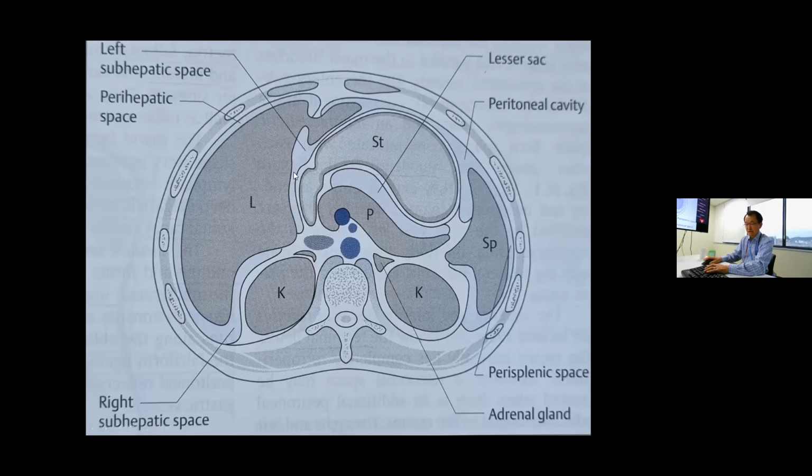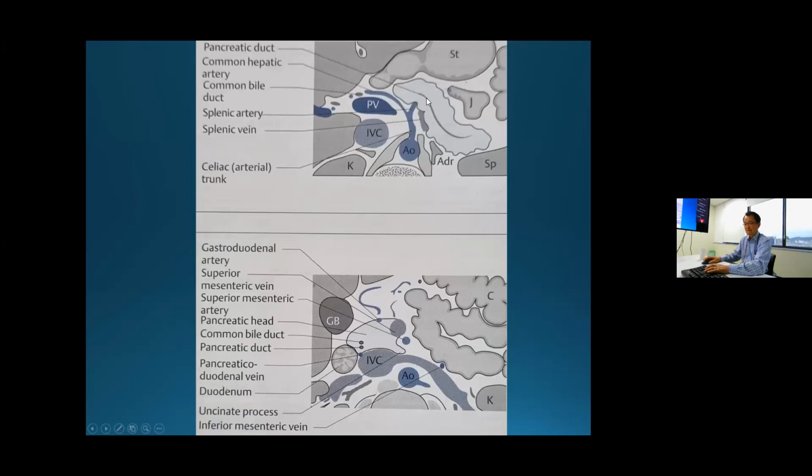And then the subhepatic space, the retroperitoneum, or the peritoneal spreading of all tumors: ovarian, stomach, pancreatic cancers. You have to look for nodules around this kind of space. Here the pancreatic duct, and all the adenocarcinomas in general, particularly in the head, make a dilatation of the pancreatic duct. That's a classical finding. If there's a neuroendocrine tumor in the pancreas, you don't see the dilatation.